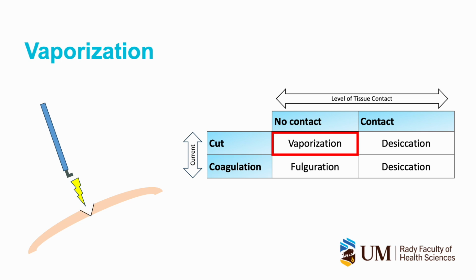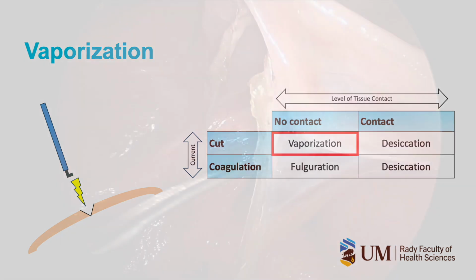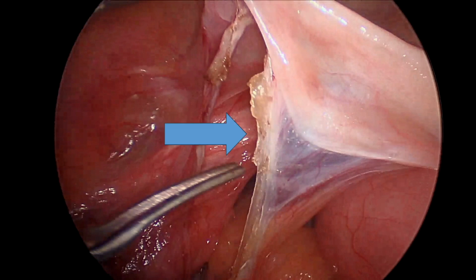This results in the rapid release of heat from tissue with a contrasting cooling effect. With this, there is limited thermal spread, allowing for precise destruction and division of tissue. In this video, rectosigmoid adhesions will be brought down from the bladder peritoneum to gain access to the left IP ligament and adnexa laying posteriorly.